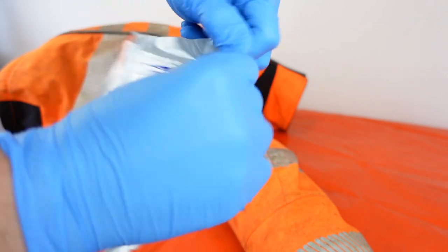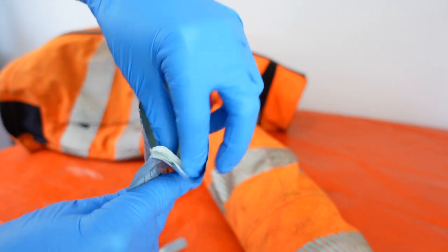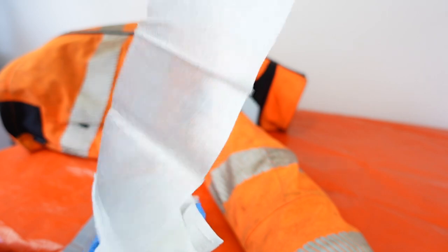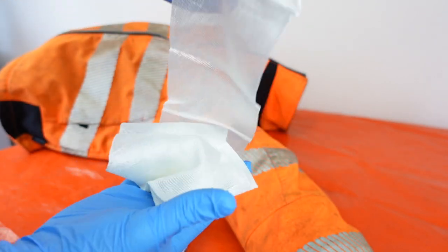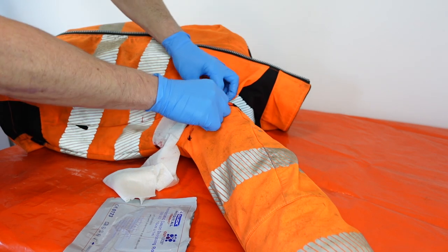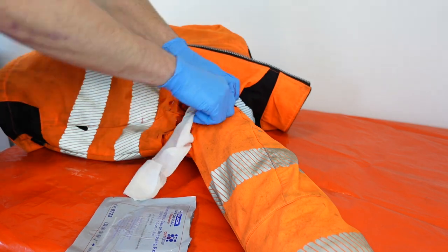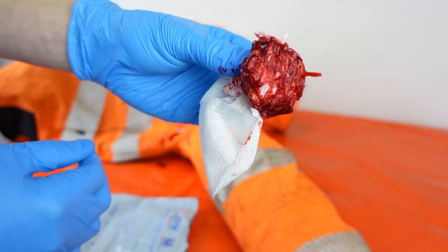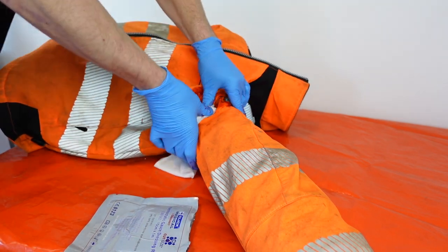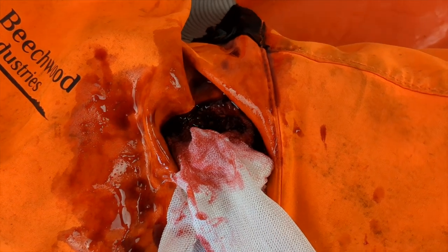The haemostatic gauze is a fantastic item. If you haven't seen it before, it can be used all over the body — other than areas like the skull and stomach — to stop major bleeding fast. Supplied is a 10 by 1 metre roll that can be packed into wounds. Once activated with liquid it creates a solid gel-like mass to temporarily control bleeding. Once packed into the wound it can be left in there to clot the blood.